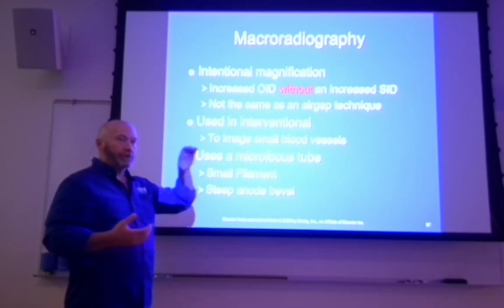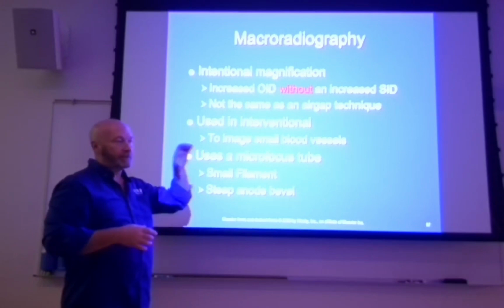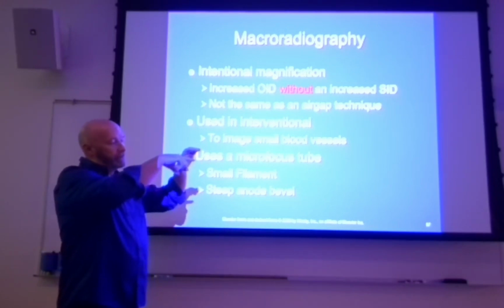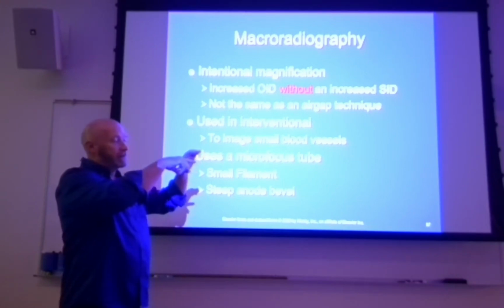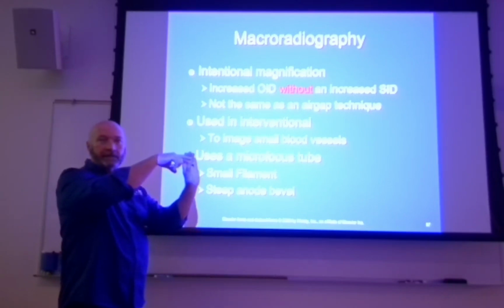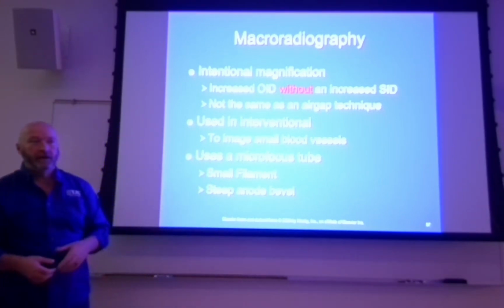So if they're just using a single C-arm setup, most of the time they're going to use two C-arms, but if they're using a single C-arm setup, then if the skull is right, and the anatomy of interest within the skull and inside the brain is in the center of that C, and they rotate that C, it remains in the center. Does that make sense? Okay, so it's convenience as much as anything else now.